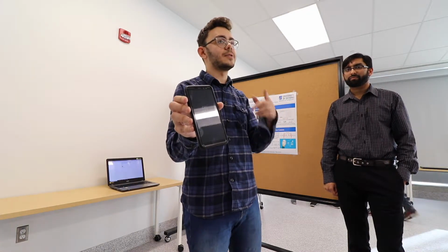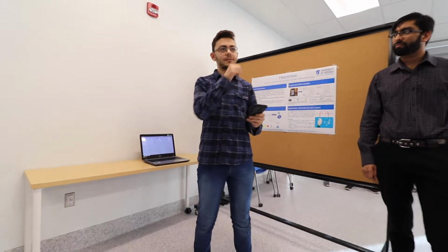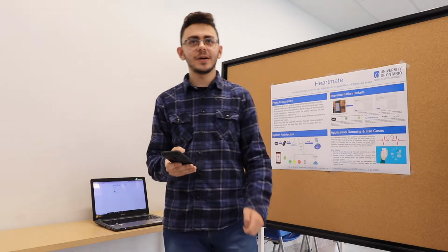It's going to tell you, hey, you're not looking very healthy. Do you want to contact emergency? And if that happens, it will contact an emergency contact based on whatever you inputted. So let's say you want to input 911, or you want to input your own emergency contact. That will work.